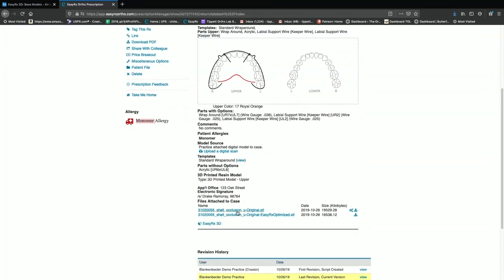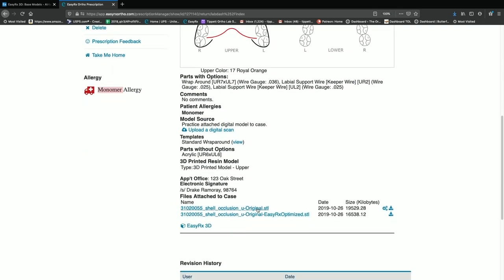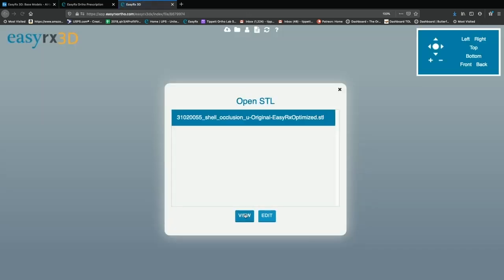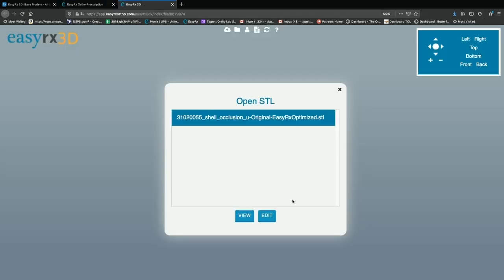So then I made this file in my fake doctor's account. Let me see if I can get this bigger. And so there's my original upload. I pulled this STL file from some other patient. And then the EasyRx has already optimized it, so I can click here. It opened up a new tab up here, so I can always go back to the file there. I'm in a new tab, still in a web browser.